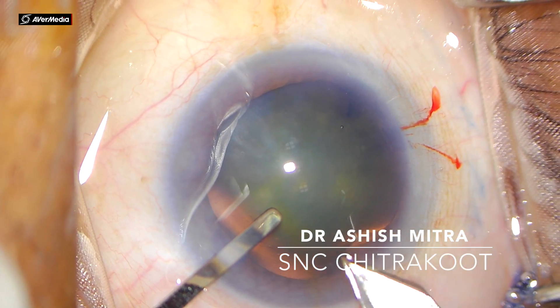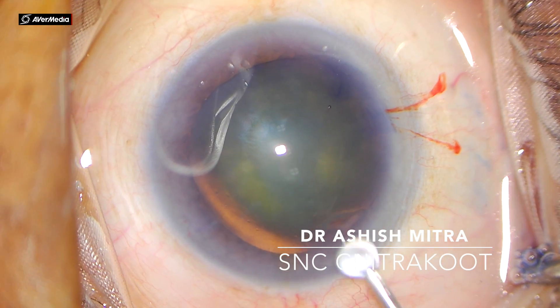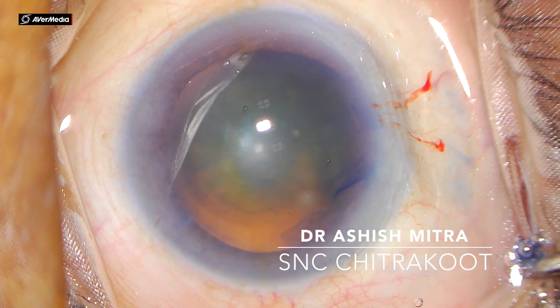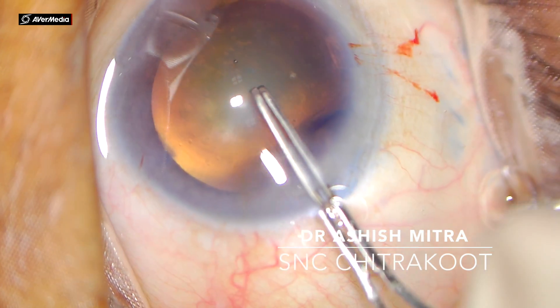You can see my incision is kind of squarish, and this is an ideal incision which is required for good phaco. Inject visco to deepen your anterior chamber and remove or lessen any thrust which is there. With both limbs of your Utrata forceps you can see how gently I will approach the anterior capsule.